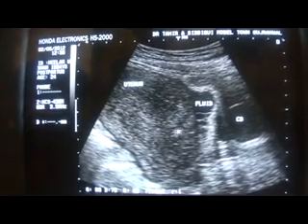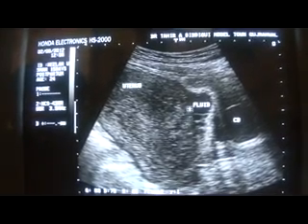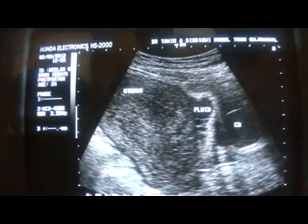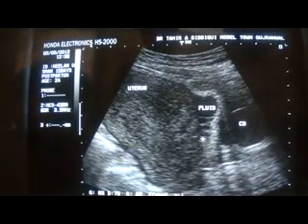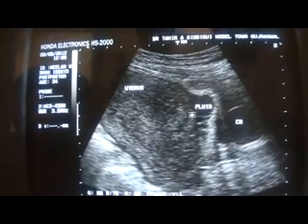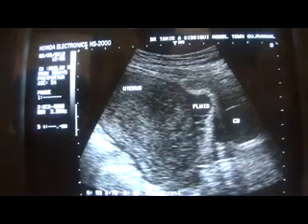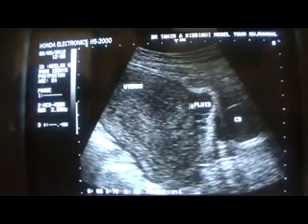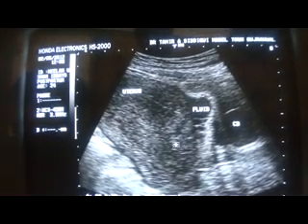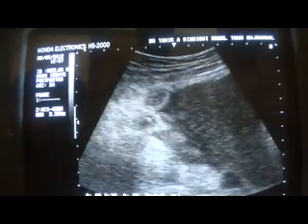This is the right side, and you can see the bowels. These are all bowels. This is not fluid, as gases can be seen. Particle movements will be seen. Coming down again. Now see, there is a significant amount of fluid in the pelvic cavity.